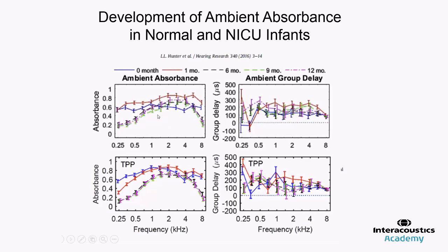However, if we're using the frequency range from 1 to 4 kilohertz, the differences between the age groups are really pretty small. So this is just further validation of the fact that most of the developmental changes are happening in the low frequencies. So that's at ambient pressure.